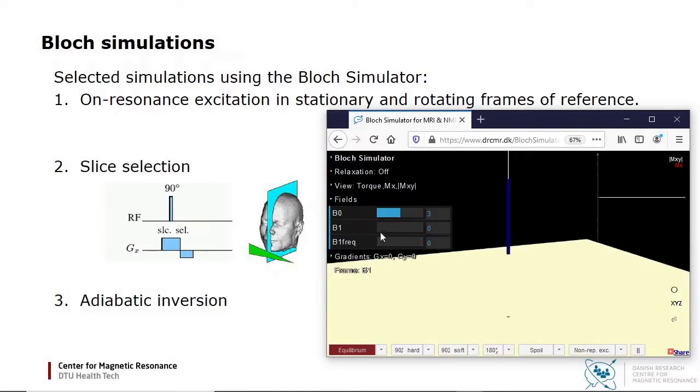Then I adjust the RF frequency far from resonance. I now turn on a weak B1 field. Since it is applied far off resonance, the effective field vector is near longitudinal initially, and the magnetization precesses around it. When I ramp up the B1 field amplitude gradually, the magnetization will therefore follow the effective field vector.